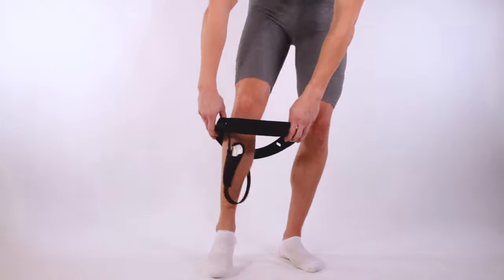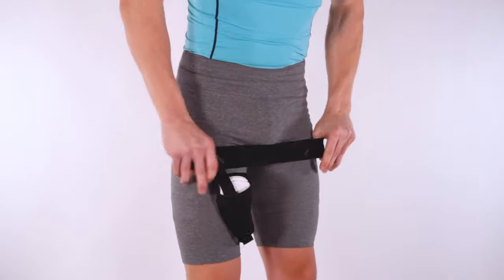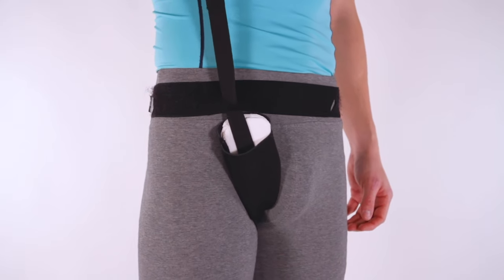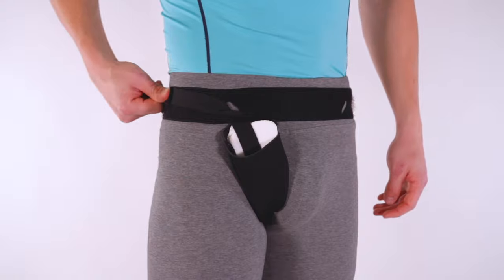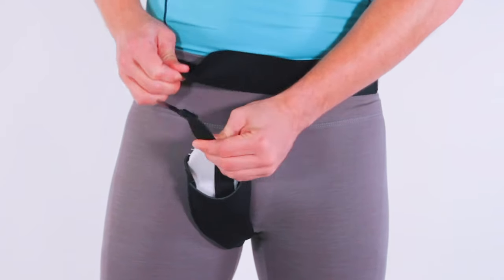Step into the brace like underwear or pants. Position the waistband at hips. Adjust the tension strap to desired level and attach the fastener. Each pocket contains three pads, removable for more or less pressure.